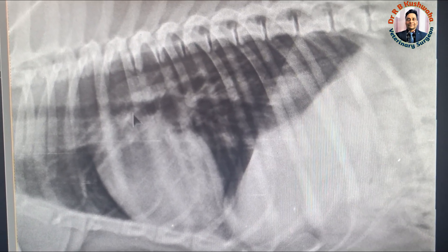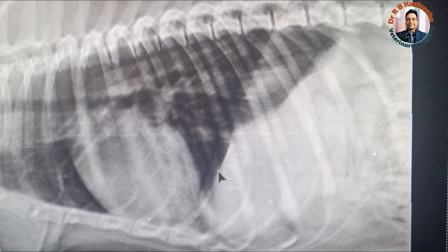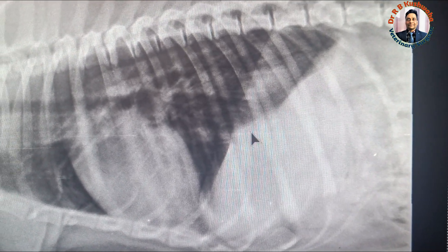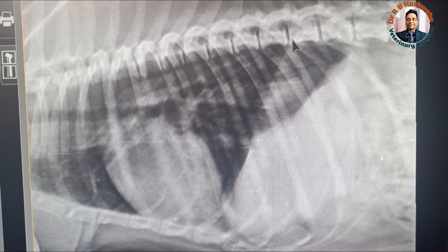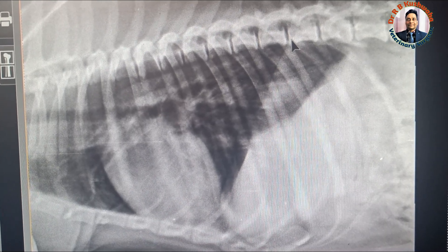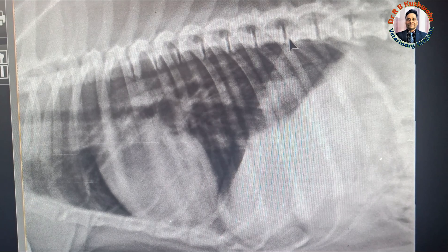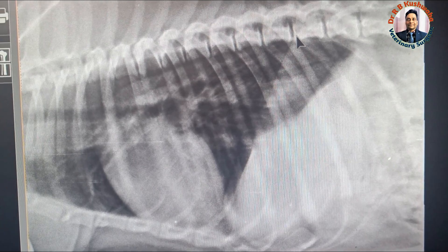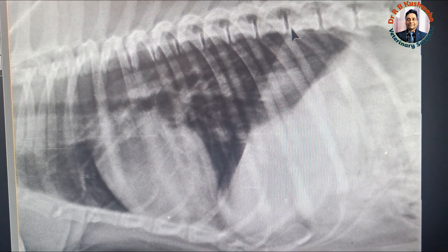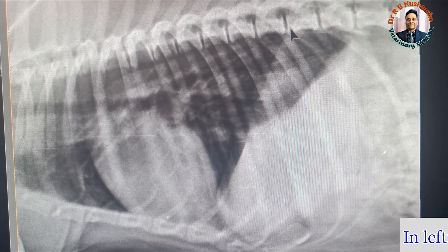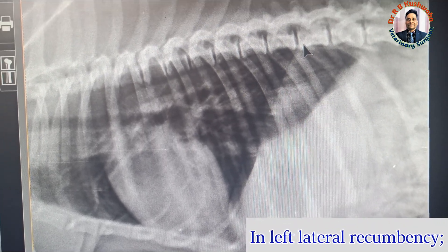If the radiograph is of the thorax region or the abdomen, and in both cases the crura of the diaphragm are present in the radiograph, then by seeing the crura of the diaphragm we can easily determine whether the radiograph was taken in left lateral recumbency or right lateral recumbency.